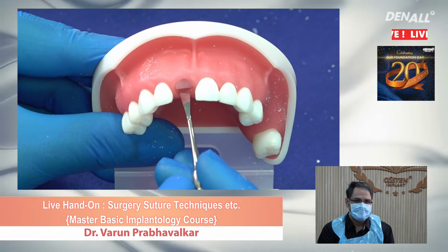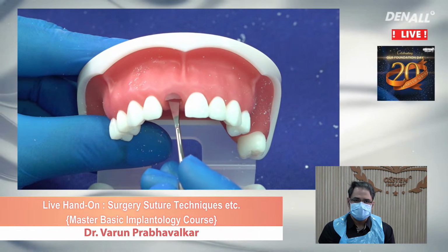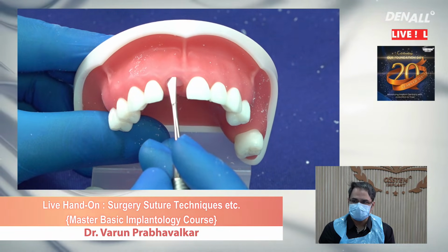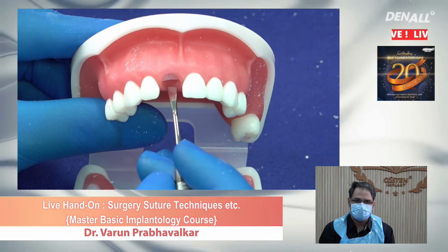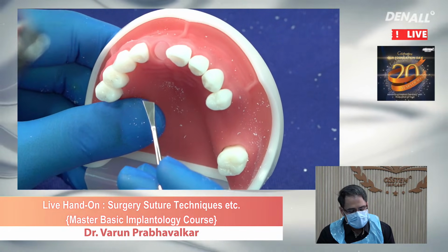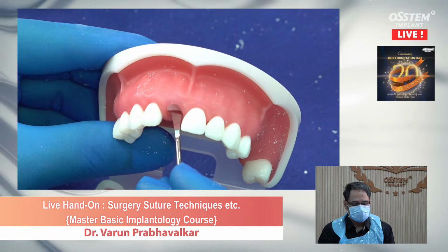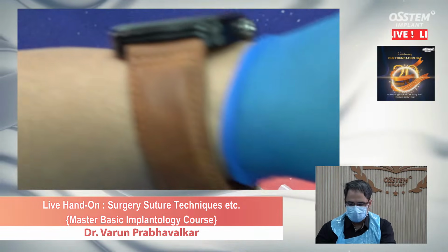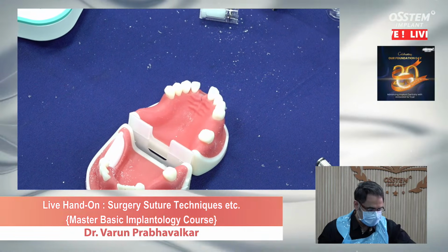And this is unusual because in patient's mouth we will not see a bone level in the palatal side lesser than the buccal side. Usually you'll see hardly a depth of 1 to 1.5 millimeter for gingival height, and that affects our placement of the implant because we have to consider the lower margin out of the two, that is palatal. Alright, I'm going to make an attempt to place an implant in this imperfect socket.